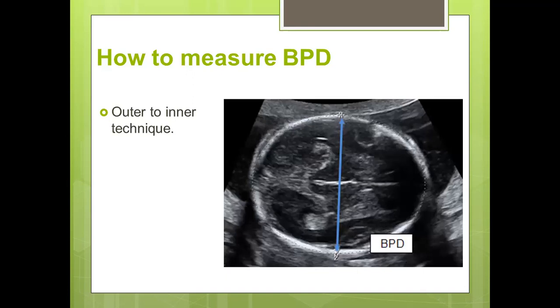How to measure? In either the lateral ventricular or thalamic view, measure from outer to inner. This is very important — not outer to outer, not inner to inner, but from the outer upper part to the inner lower part.